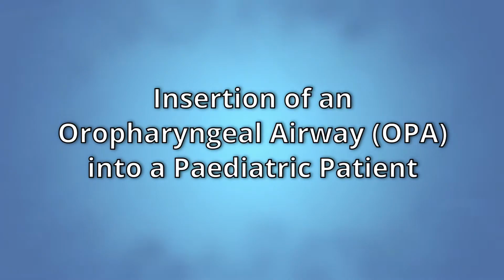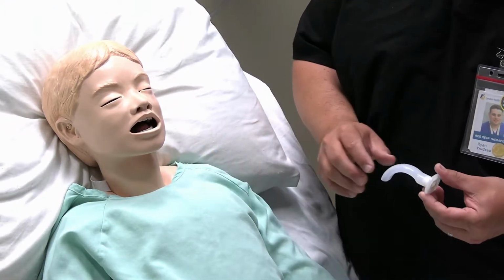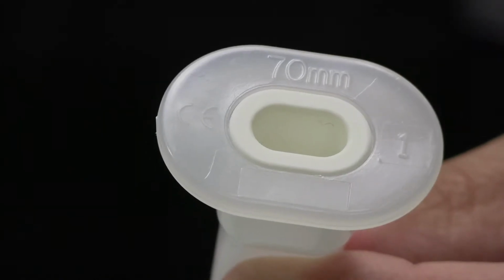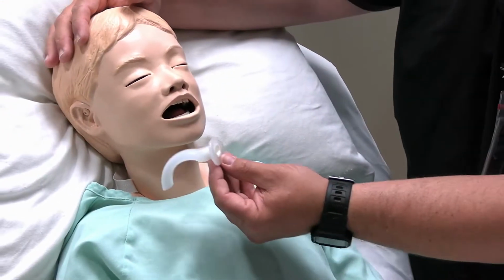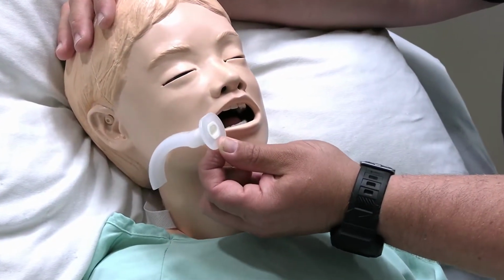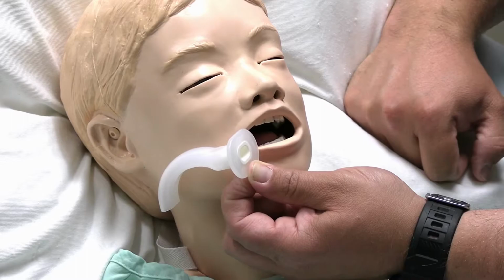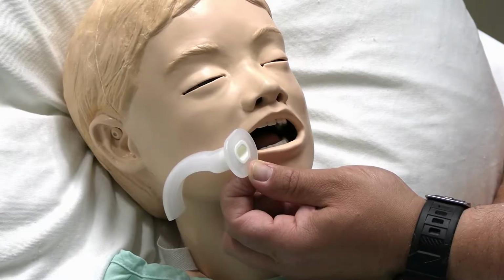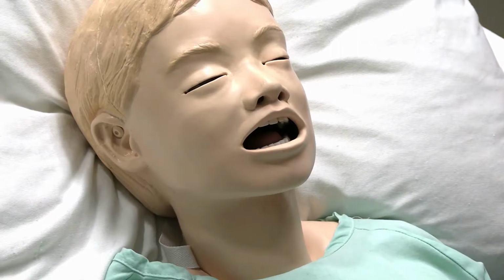Next, we're going to size this child for an appropriately sized oropharyngeal airway. One thing you can do is look on the front of the flange, and it will tell you the size of the oropharyngeal airway. The other thing is you can use the side of the lip to the angle of the jaw. You should have the tip of the oropharyngeal airway at the angle of the jaw, and then the flange will be at the side of the lips there. So that looks like an appropriately sized oropharyngeal airway for this patient.